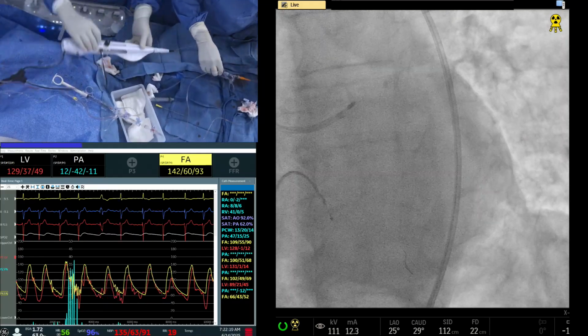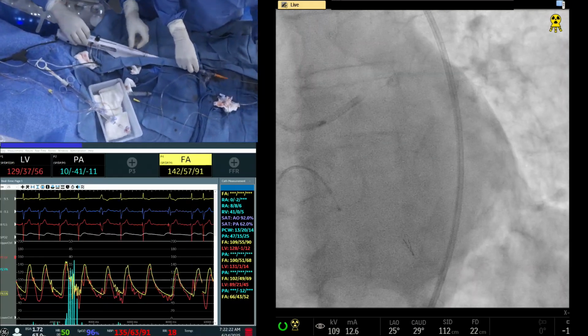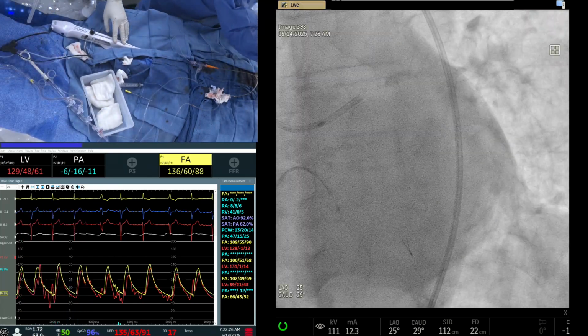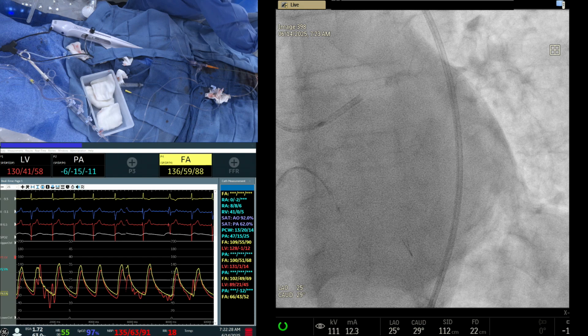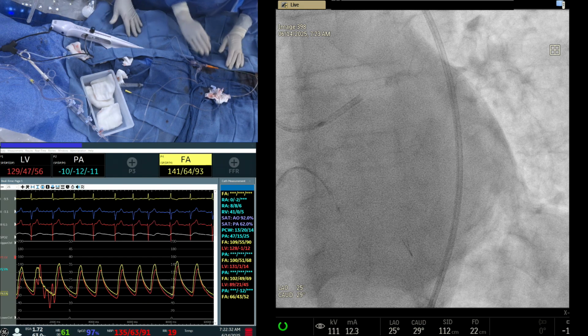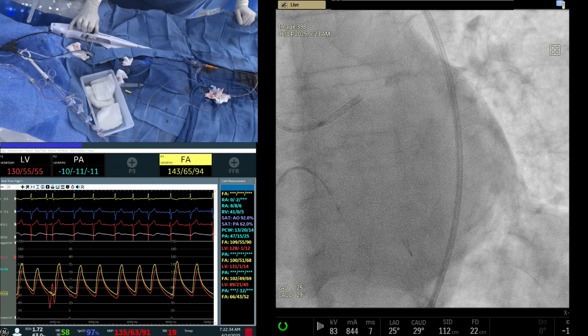Did we check the speed outside normally? Yeah, we did, we did already. With the Rota Pro, the speed of 150 is fixed, so we do not check it like we used to in the legacy anymore. Yeah, but we did.